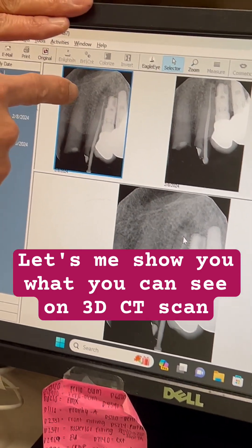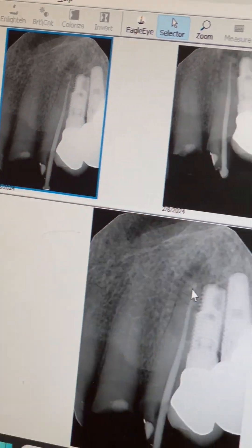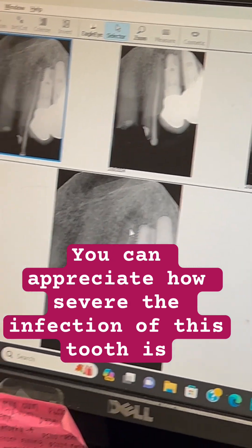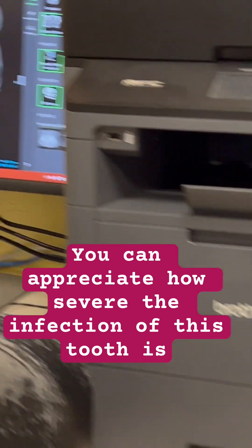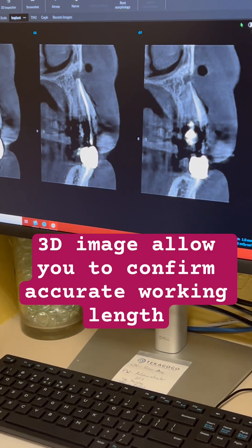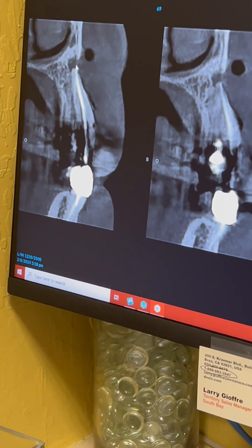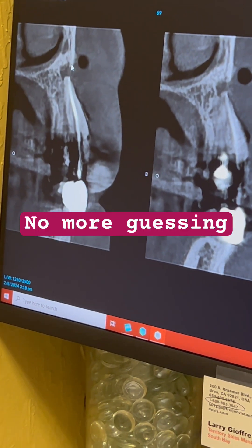And then the quality of the bone — you feel like it's not too bad, right? But here I want to show you how severe the infection is. This is very infected too. Same tooth, same patient. With the 3D, what you can see is how severe the infection that penetrates the face.